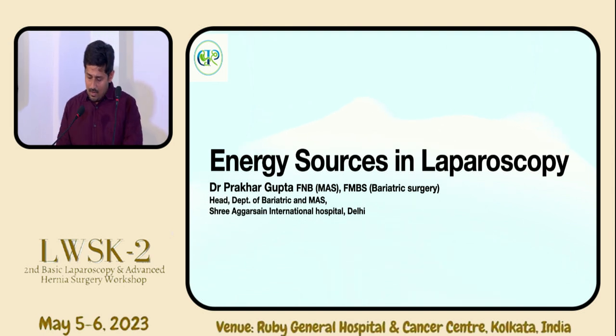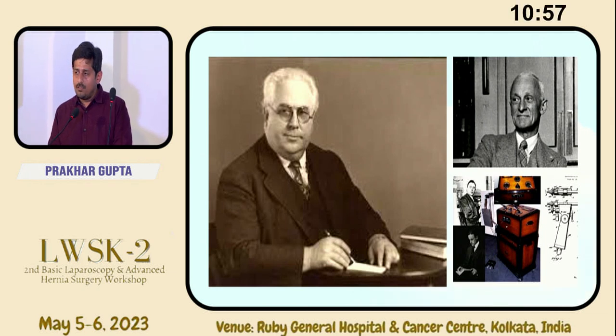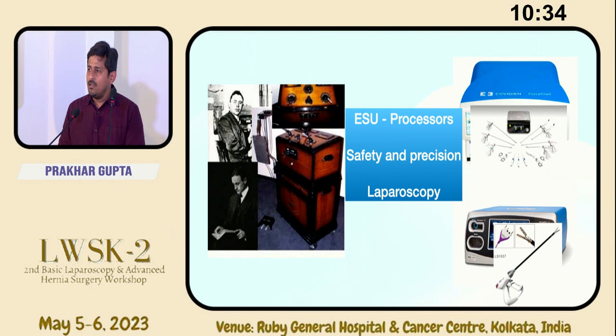With the advancement in the technologies, we are now able to complete even the most complex procedures safely and laparoscopically. The history dates back to the 18th century, but it was only in 1926 when Dr. Harvey Cushing and Bowie used the first electrosurgical generator for a neurosurgery. From then till now, we have come a long way. The units which we have nowadays are actually intelligent. They have a processor in them which senses the current and stops it whenever not required. So it has led to safety and precision.